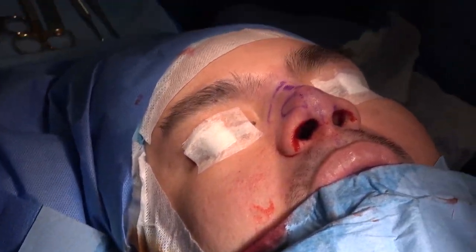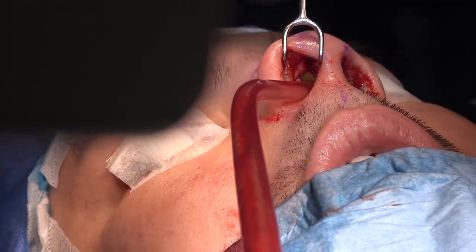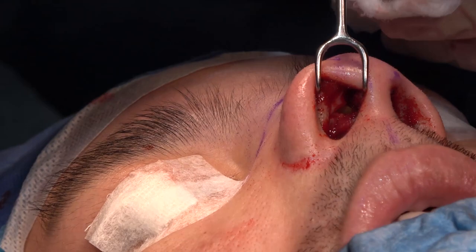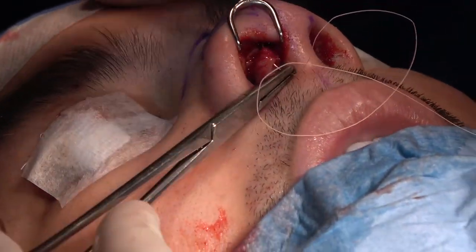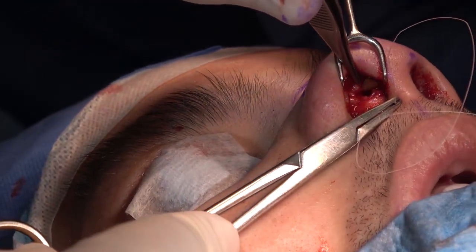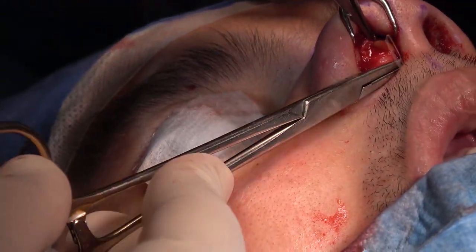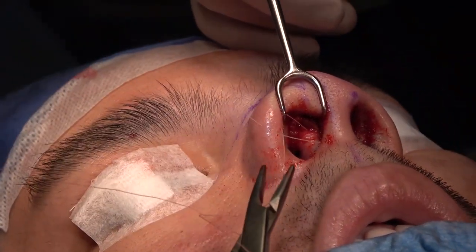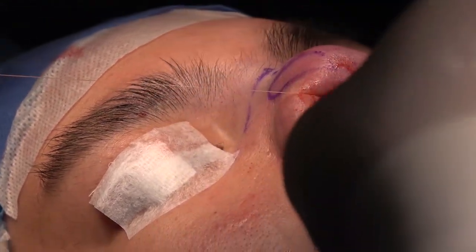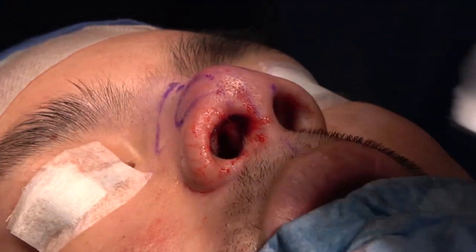And let's now try maybe to fix it with suture if we need, if we do not need it even. Let me check. Okay, suction. In the graft, you can see the graft there sitting nicely. Give me the suture. We'll fix it with a suture, push it to the midline, and then hold in the graft. Leave it now. Just don't squeeze. Just make sure that the graft will stay in the midline. Okay, it's fine.